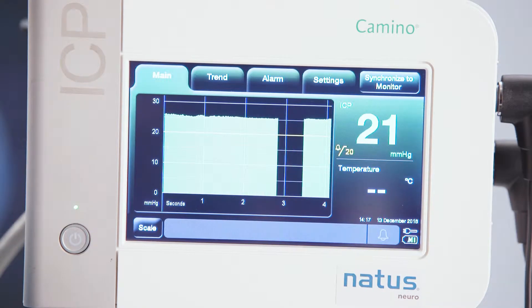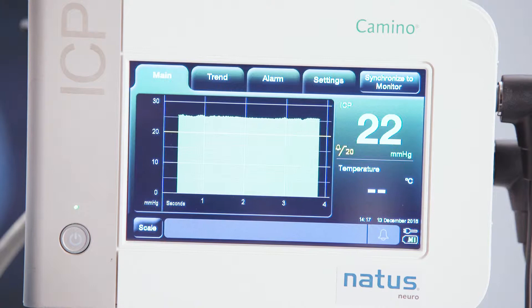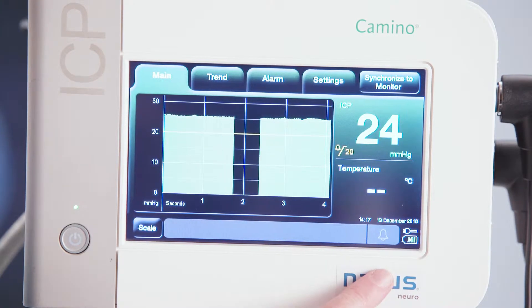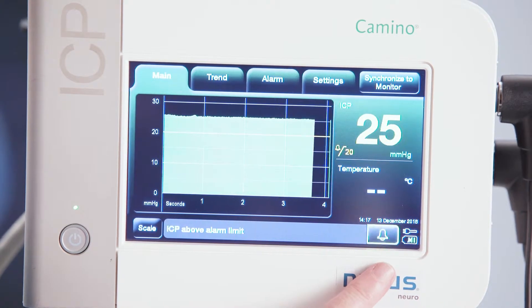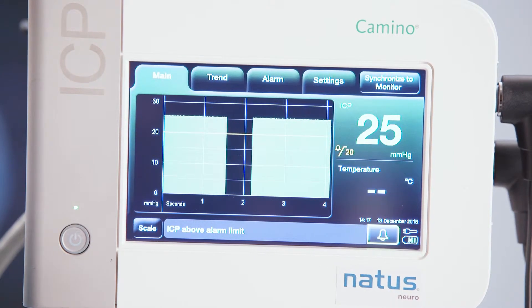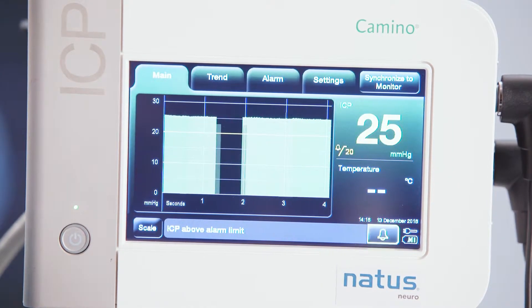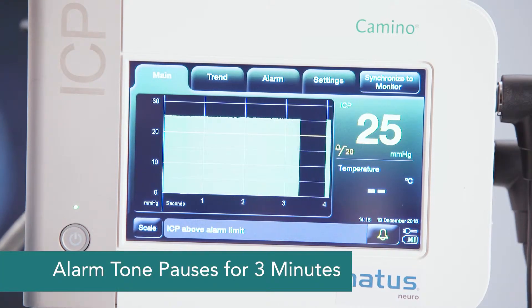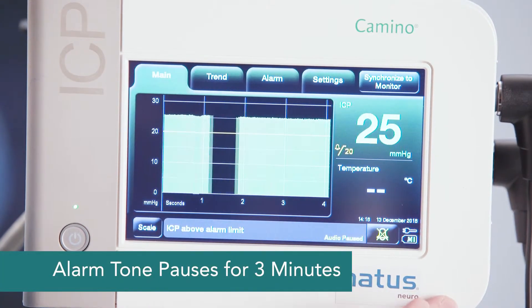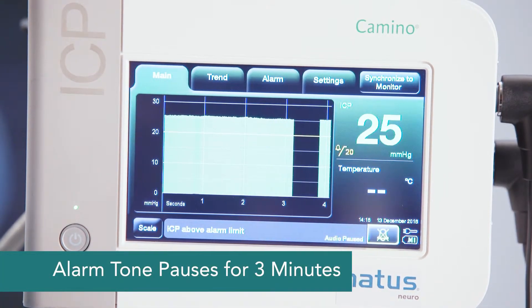Now let me show you what would happen if my ICP was higher than 20. I'm going to adjust my ICP value. As it climbs, you'll begin to see down here in the bottom left-hand corner that this bell is going to flash bright yellow, and you'll hear an audible tone. To pause the alarm, I touch the yellow button and it pauses it for three minutes.